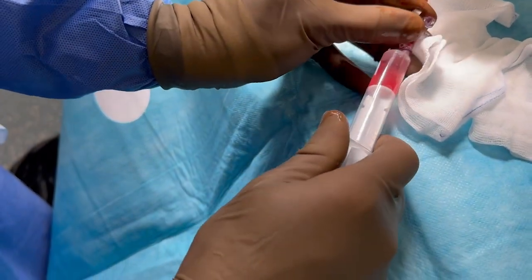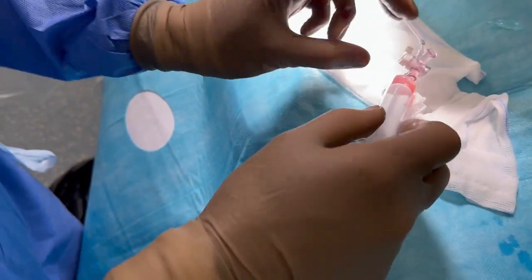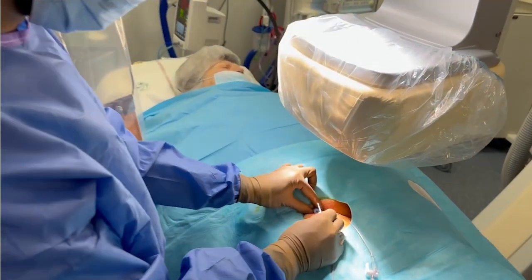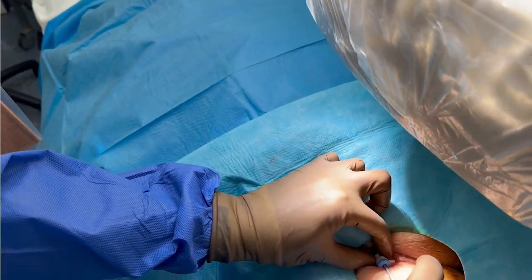After removal of the dilator, check whether there is venous blood return from the introducer. We can now advance a steerable electrophysiology catheter into the right heart.